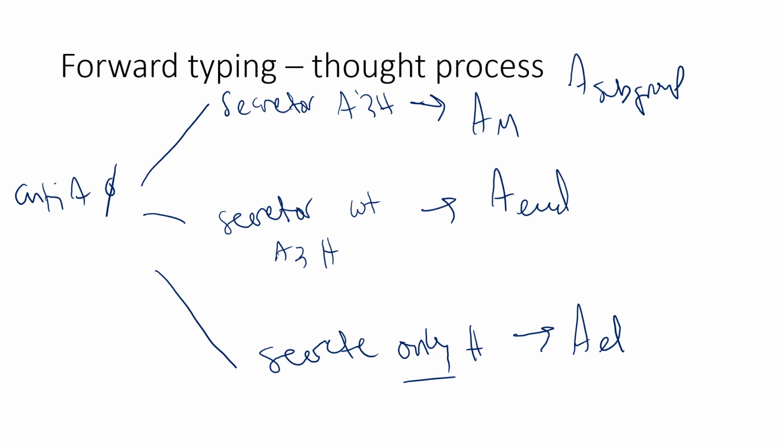So these are the A subgroups. There's no anti-A reactivity compared to the prior slide where there's weak reactivity with anti-A reagents. And again, you can identify these molecularly. They can be a little tough sometimes depending on the genotype, the type of genotyping you run. And so serologically, you can get pretty close to what the answer is.